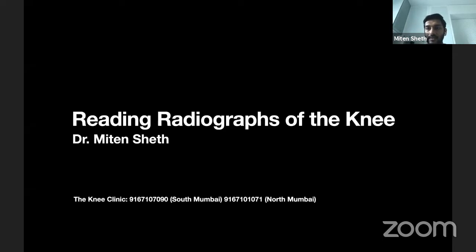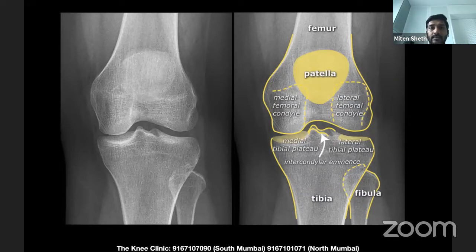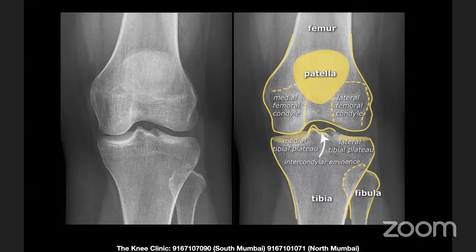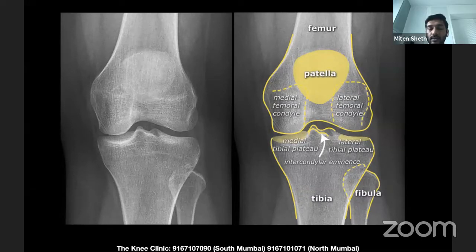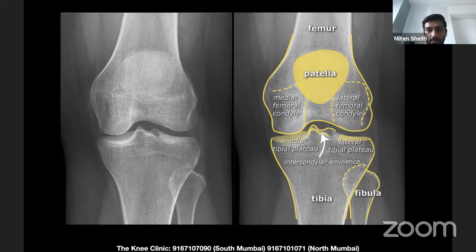Today we're talking about reading radiographs of the knee. What do we want to see in these X-rays? A simple anterior-posterior view, a lateral X-ray, and a skyline view of the patella are the three common X-rays everyone talks about. On the AP view, we're looking at four bones: the patella, femur, tibia, and fibula.